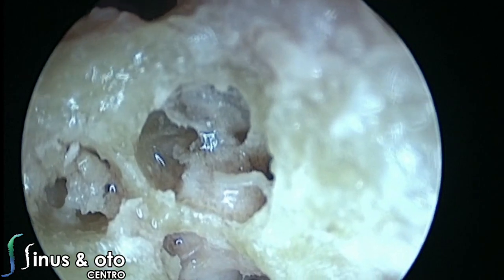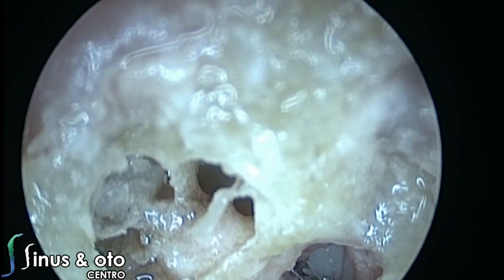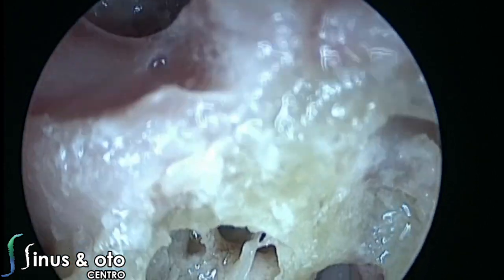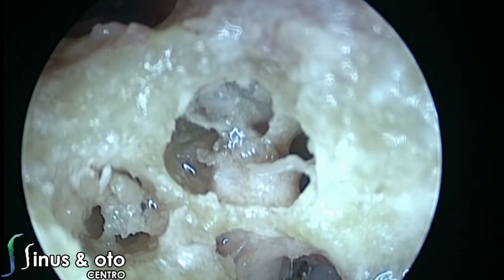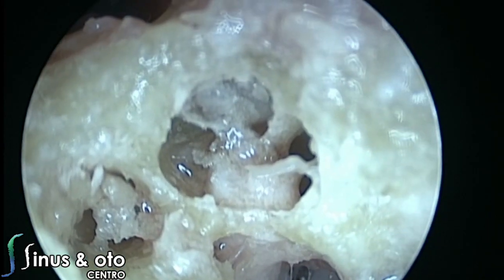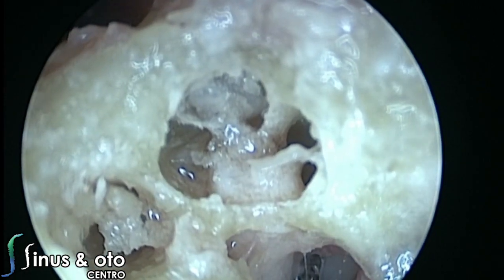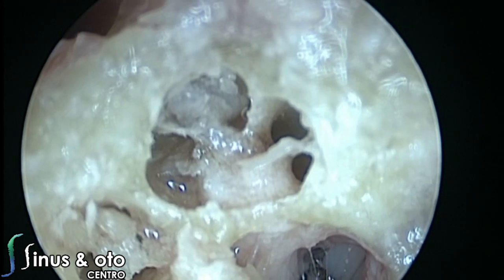So it's a very interesting anatomy. It's a different way to look at this anatomy, going through this endoscopic approach, this endoscopic access. And of course, this can be used for some selected cases of vestibular disease, some cochlear disease in symptomatic patients with problems.